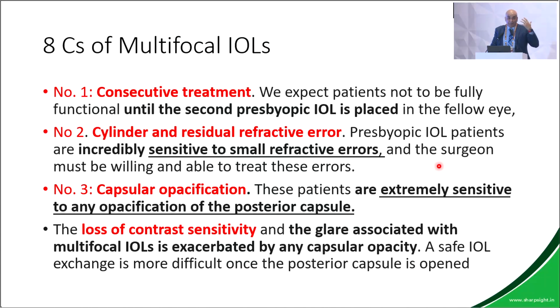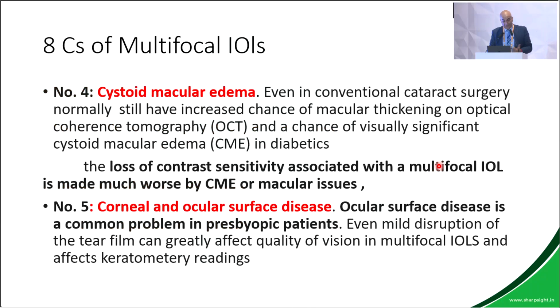The multifocals are very, very intolerant to residual astigmatism. Capsular opacification, even a slight amount of capsular opacification in a multifocal, can really trouble the patient. Loss of contrast in multifocals is far more damaging than with EDOF or monofocal lenses. If the patient, God forbid, has a macular edema with a multifocal lens, the patient is probably going to shoot you. Any amount of surface disorder is more unforgiving with a multifocal than with an EDOF.